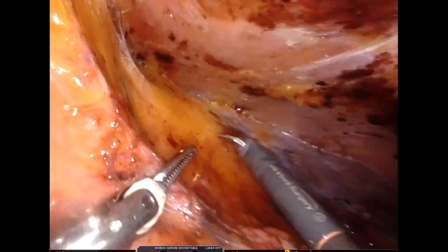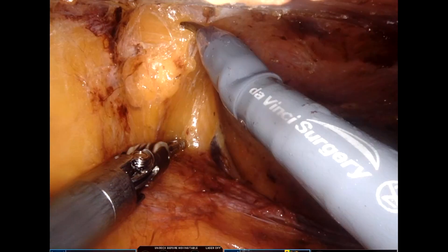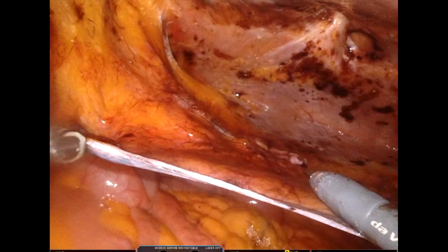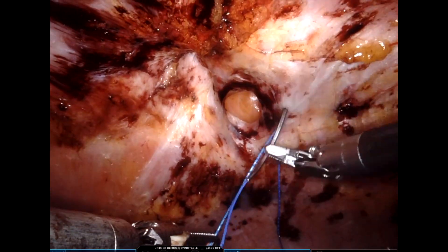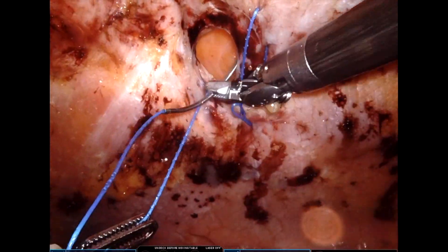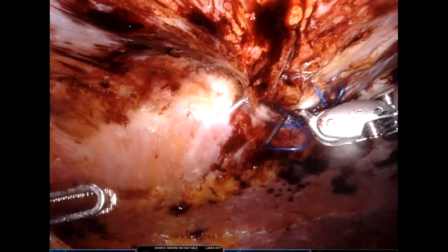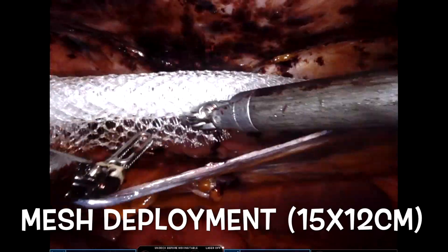We also go a few millimeters or a centimeter more beyond the predetermined areas of dissection — this helps with better placement of the mesh. We use a barbed V-Loc non-absorbable suture for defect closure. After taking a few rows of sutures, we reduce the intra-abdominal pressure to 6–8 mmHg and then approximate the sutures. Here we are closing the hernial defect as well as the umbilical ring area, and then we divide the suture using a suture-cut needle driver.